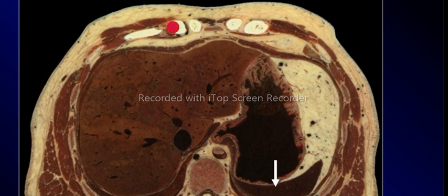This is the liver, this structure here, this brown structure. And this is the IVC going through the liver. These are the hepatic veins. This is the left, middle, right. And you have the diaphragm there, separating the abdominal cavity from the thoracic cavity.